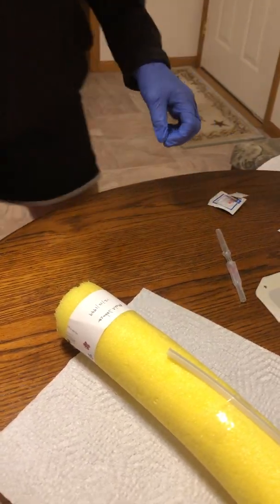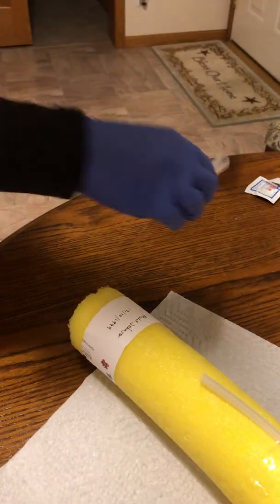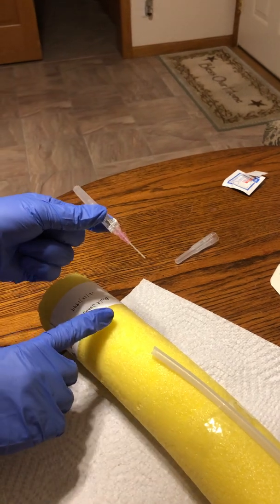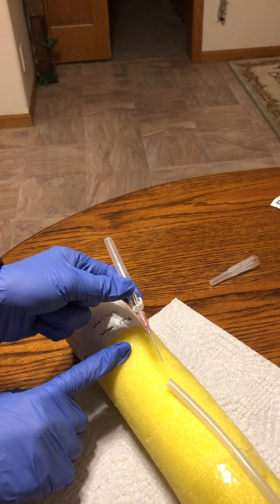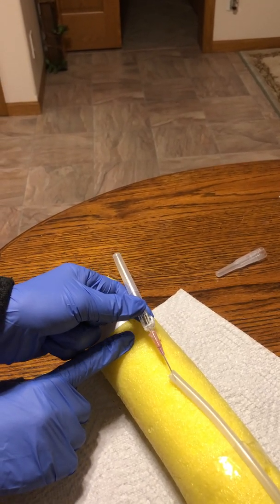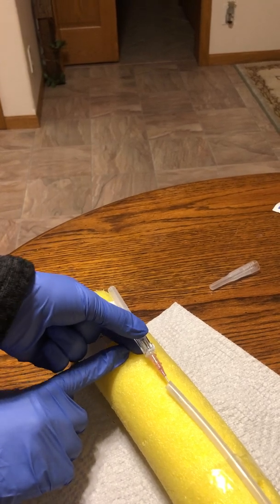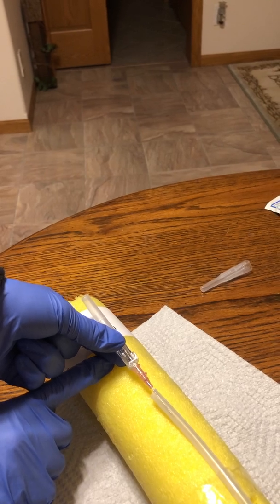Then I will take my needle and make sure that I pull the skin taut, and at a 30 to 15 degree angle I'm going to go in. And then once I can see the red, the flash, I'm going to go down to be parallel just about, and then I'm going to insert another half centimeter.